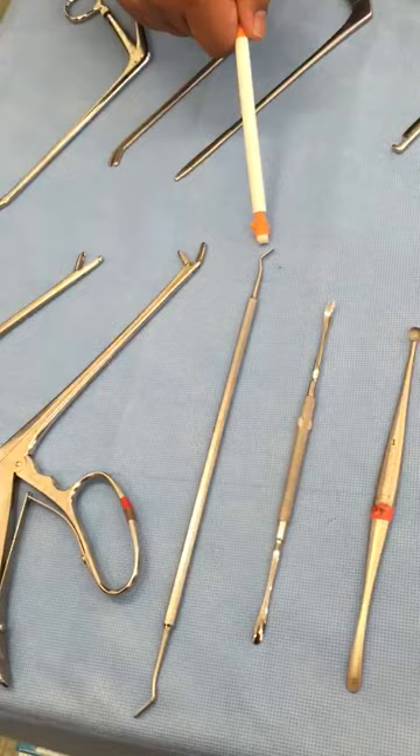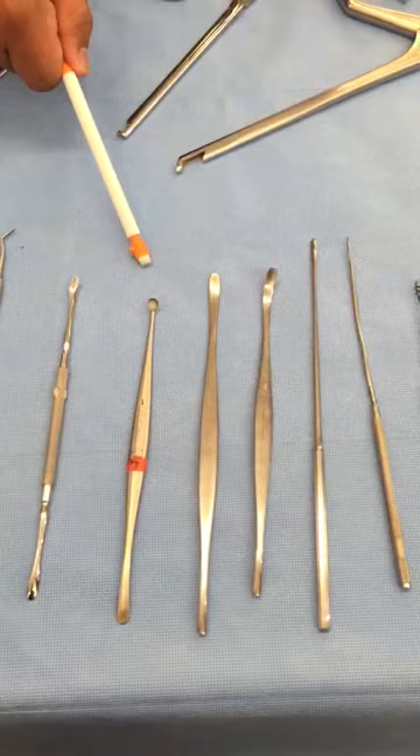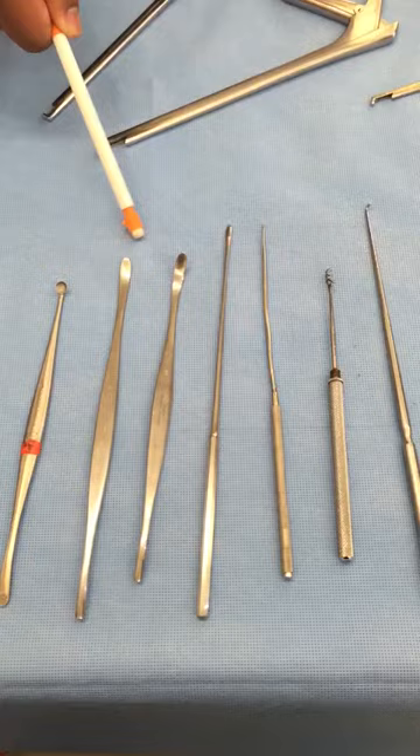Woodson Dissector. Freer Elevator. Number 1 Penfield Dissector. Number 2 Penfield Dissector. Number 3 Penfield Dissector. Number 4 Penfield Dissector.